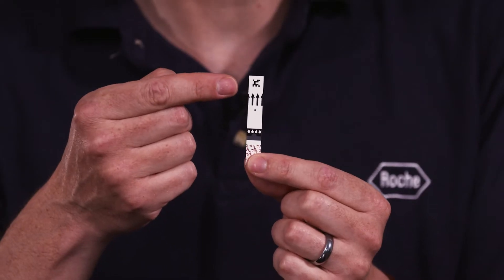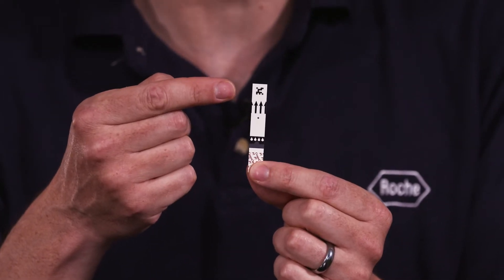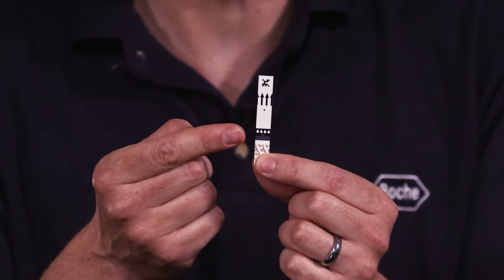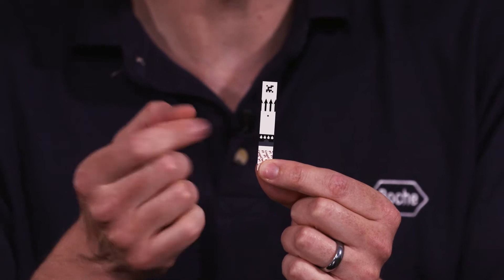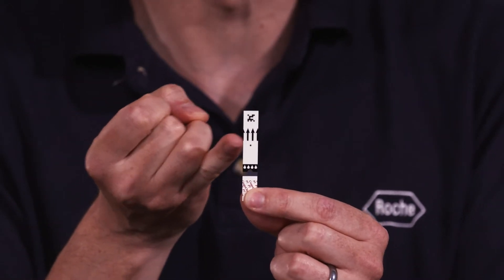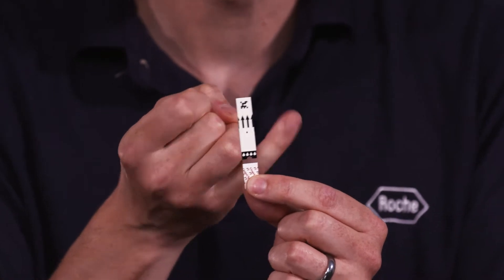The arrows on the strip indicate the direction you're going to insert the strip into the meter, and the clear section is where you're going to apply your blood. You can apply the blood to the top of that clear section or to either side of the clear section. The sample volume is 8 microlitres, and to give you some sort of image, that is a ladybird sized drop of blood.